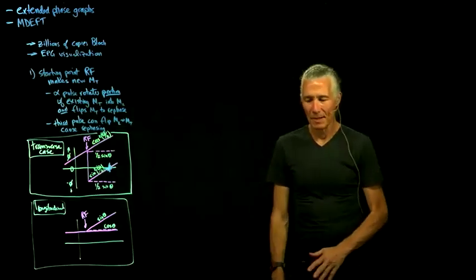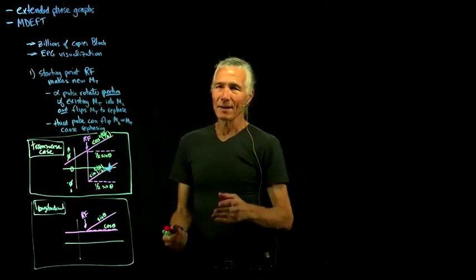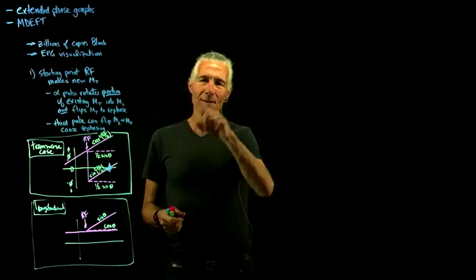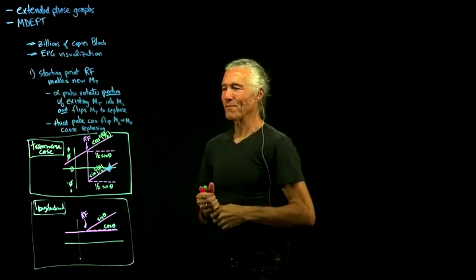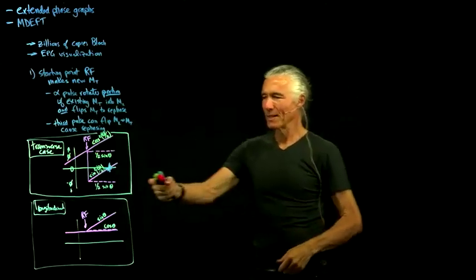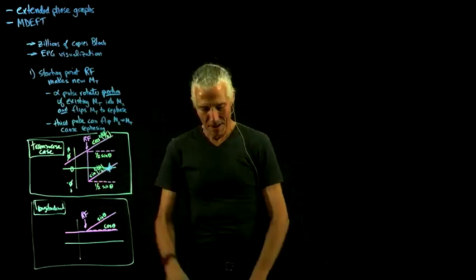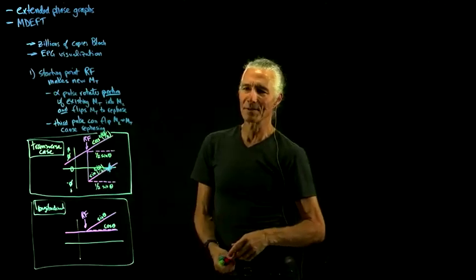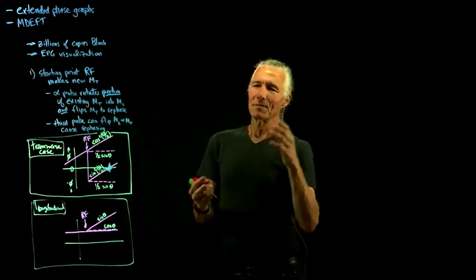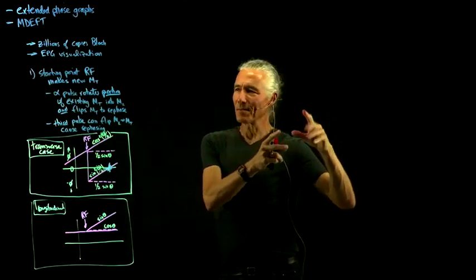So we're just going to re-diagram that 3 echo diagram, but just to look at all the different phase pathways or sort of phase dispersion pathways using these rules. And I'll update the notes with some better annotations so you can sort of make heads or tails of the diagram, because after these phase pathways start to build up, you could have hundreds of them sort of piled up.